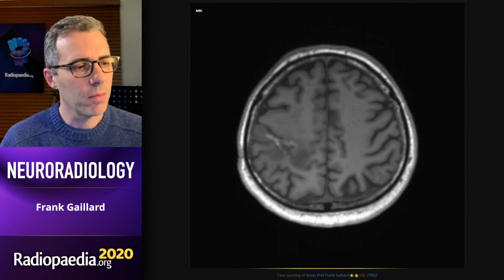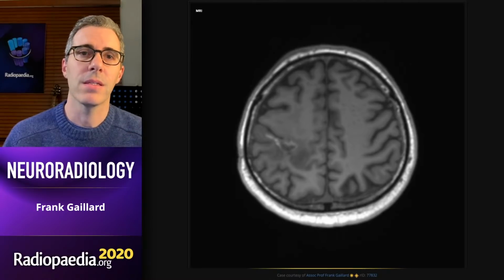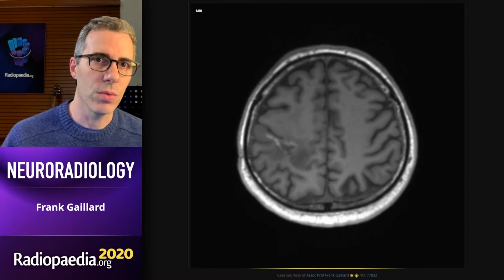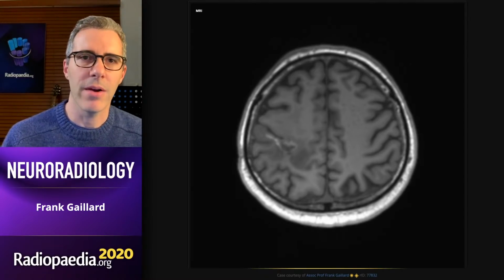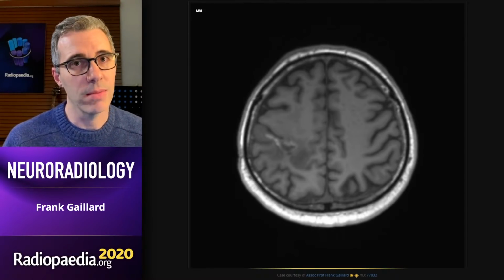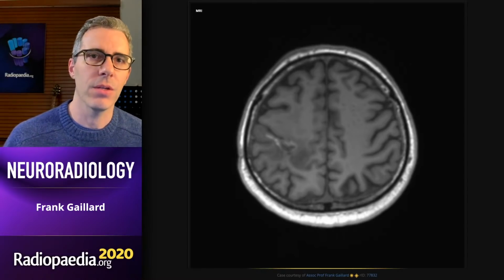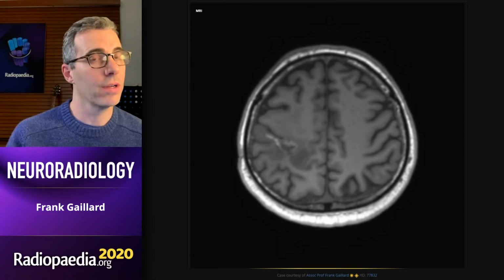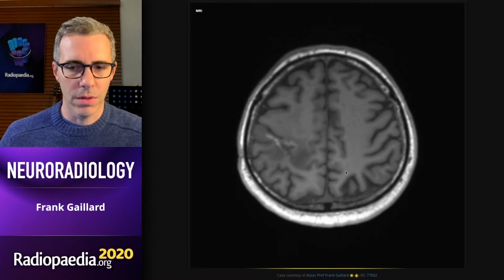The problem, both for us and for patients, particularly for us, is that it is a tremendous restorative factor on the blood-brain barrier. It's like steroid, but like version 24 of steroid. So it creates an intact blood-brain barrier and therefore stops edema and stops enhancement. And so if you're used to focusing on edema and enhancement, particularly enhancement, as the determining feature that you're going to base your assessment on, you're going to make mistakes in calling response when in fact you don't have response, the tumor's happy, just not enhancing and not edematous anymore. So let's try and work out which of these two this patient went on to get.